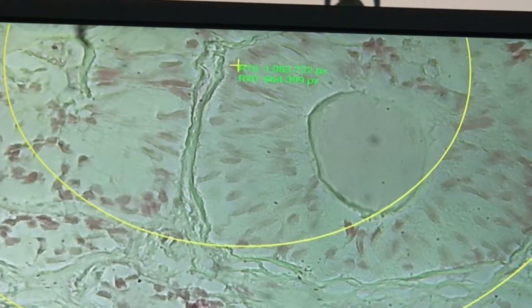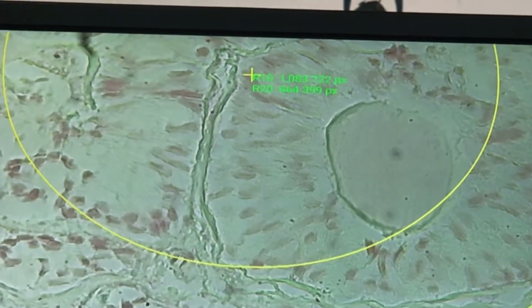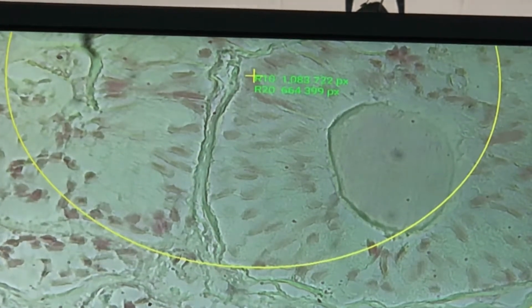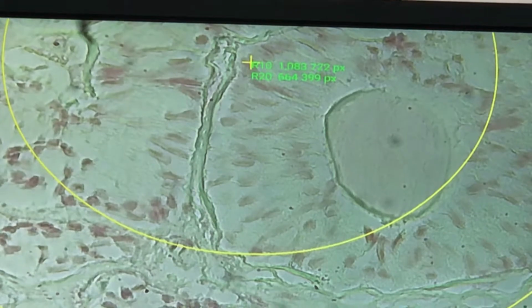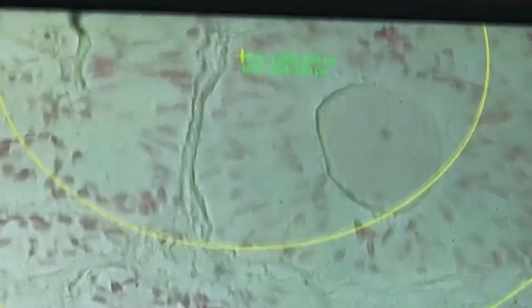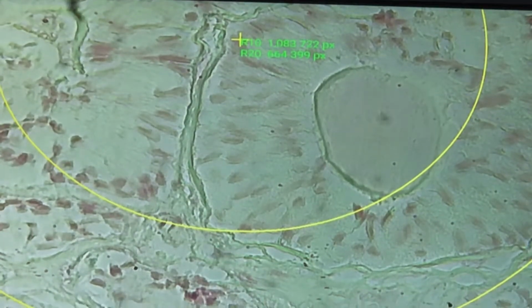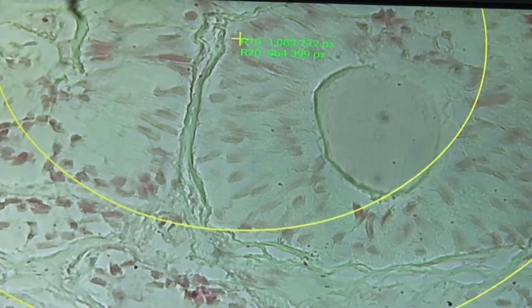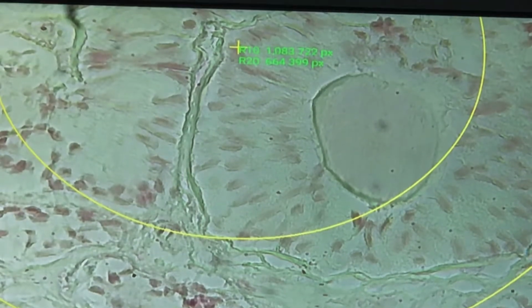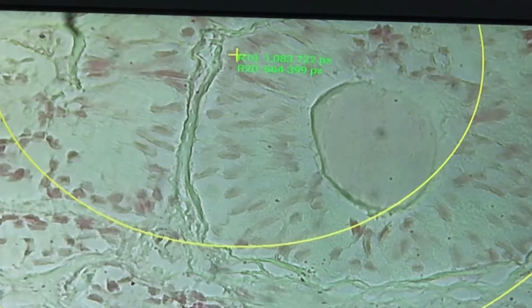It's in which you can see the spermatogonia. When you describe the cells, they are no longer bluish in color. Normally, spermatogonia are bluish in color, which means they have abundant mitochondria or abundant ribosomes. But here those cells are already pale in color, somewhat pale pink and hyalinized. So this will signify an atrophy of the testis. This is taken from a patient with undescended testis.